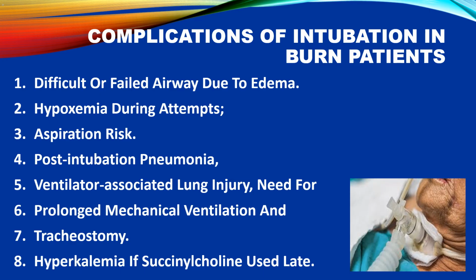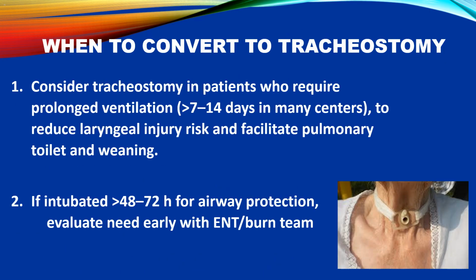Early recognition and management of these complications can help improve patient outcomes. When to convert to tracheostomy. 1. Prolonged ventilation. Timing. Consider tracheostomy in patients who require prolonged ventilation, typically greater than 7-14 days. Benefits. Tracheostomy can reduce laryngeal injury risk and facilitate pulmonary toilet and weaning.